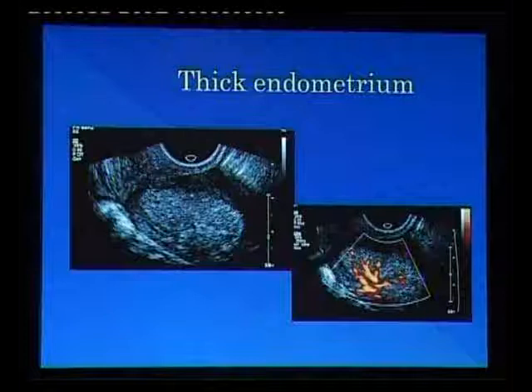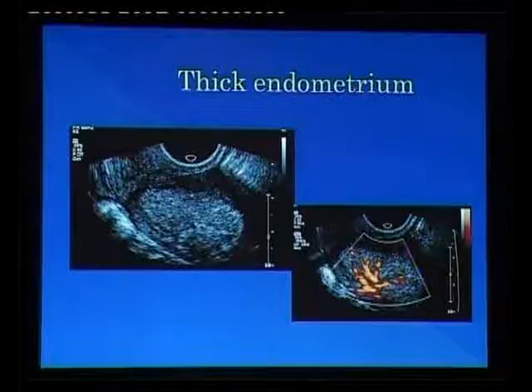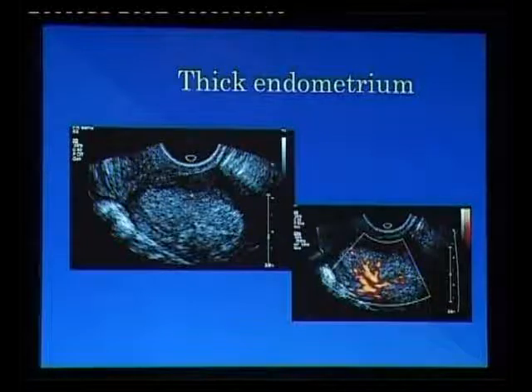So Praveen has talked about CA endometrium, and he also pointed out that ultrasound as well as color Doppler has limitations in day-to-day practice. And he also pointed out in his last slide that maybe contrast and elastography will be useful to us. So let's see how they are useful to us, especially contrast.